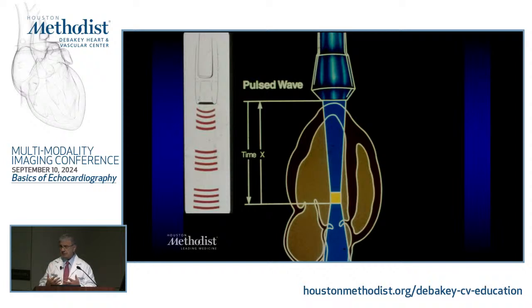And we use for this a fast Fourier transform analysis, which is a complicated way to solve what really happened to this. Just imagine mumbo jumbo of what happened to these frequencies. And that's where you come up with your spectral display of what the velocities are over time. It's really very accurate. That's number one. Number two, it has a good time resolution to it, right? But this is the pulse wave Doppler technology for you to be able to tell at the tip of the mitral valve, in the LV outflow tract, whatever that you want, what the actual velocity is.